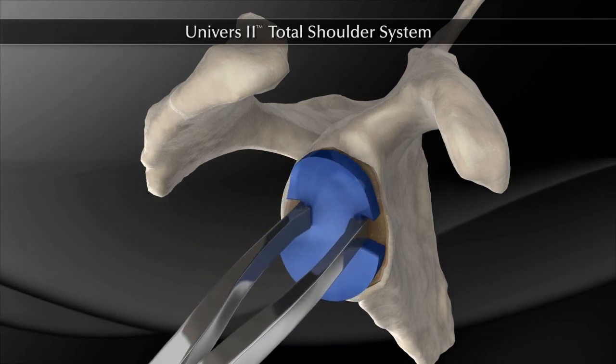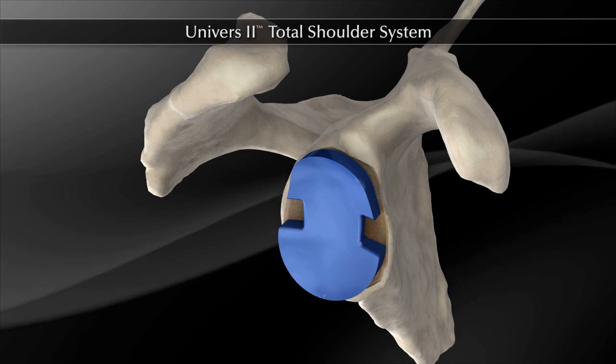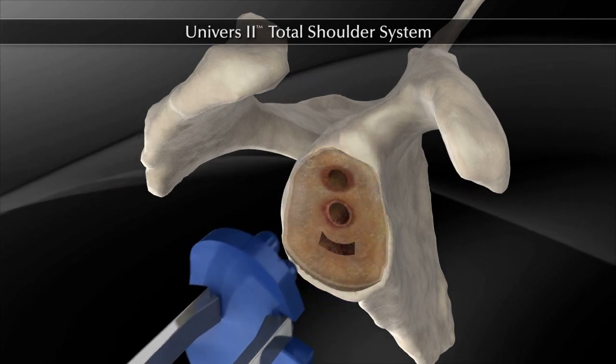The trial glenoid of appropriate size is inserted. Verify that the trial is fully seated against the glenoid surface to ensure proper fit of the actual glenoid implant. The glenoid trial can now be removed with the trial forceps.